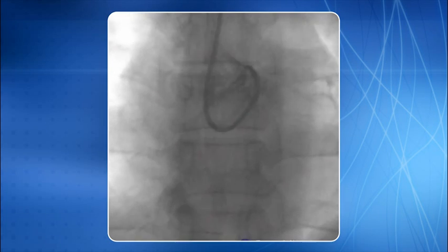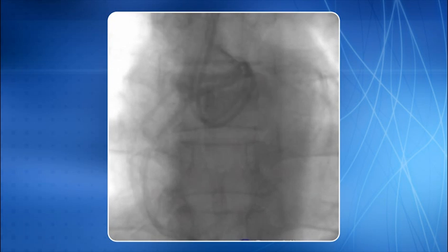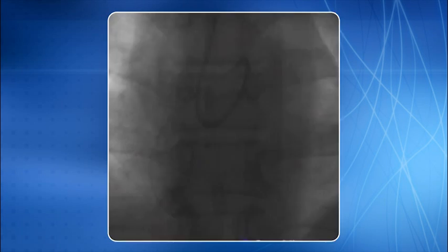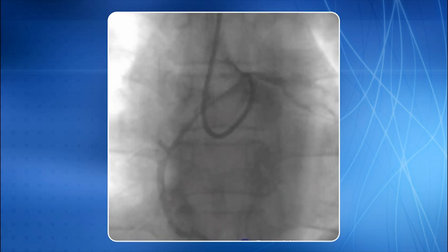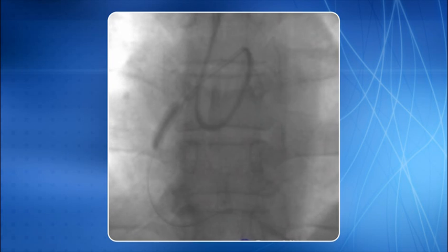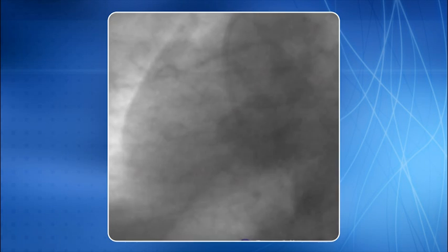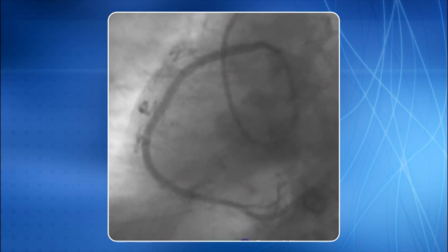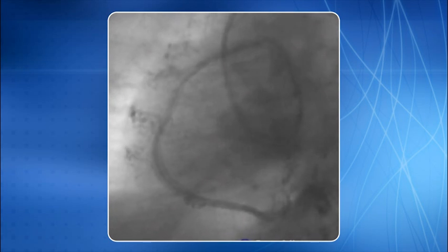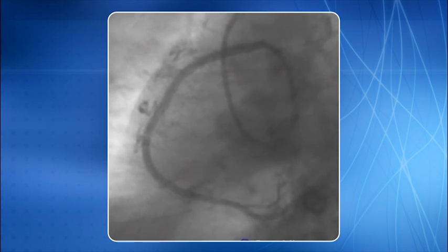Here is an example of an anomalous right coronary artery arising from the left coronary cusp. The JL 3 guide catheter is the best catheter to cannulate this artery. Stenting is in progress, and the final result shows excellent coaxiality and backup support provided by the JL 3 guide catheter.